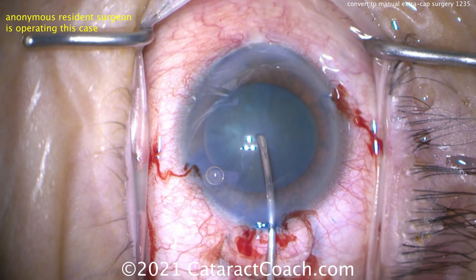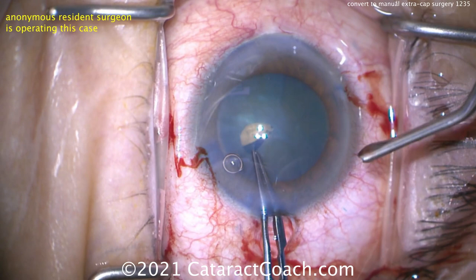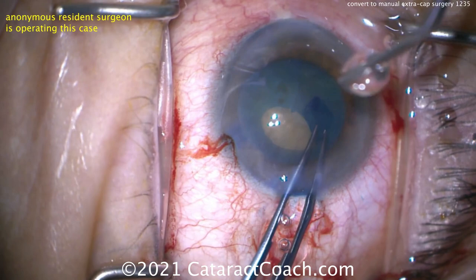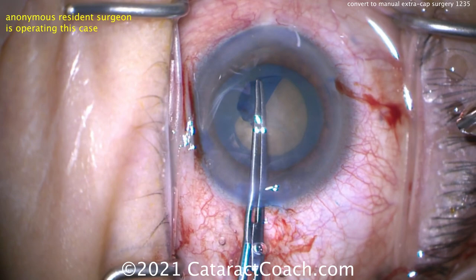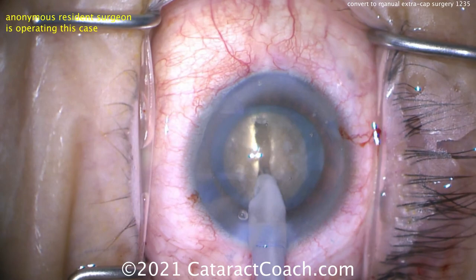Here's the patient. You see a dense nucleus stained with trypan blue. The resident is going to create a capsulorhexis. This patient is hyperopic, put in a higher power IOL like 26 or 27 diopters. This patient has a smaller anterior segment — the white-to-white is smaller and the dilation is only about 5 millimeters. The resident is making too small of a capsular rhexis, probably 4.5 millimeters at best. You want that rhexis to be much bigger.